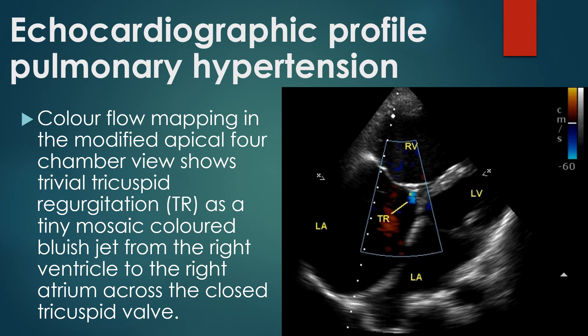Color flow mapping in the modified apical 4-chamber view shows trivial tricuspid regurgitation as a tiny mosaic-colored bluish jet from the right ventricle to the right atrium across the closed tricuspid valve. The Doppler cursor can be aligned to the jet only with great difficulty and a good envelope may not be obtained. Hence, estimation of right ventricle systolic pressure from the TR jet will be difficult in this case. Multiple tilted views may be imaged to get better TR signals.